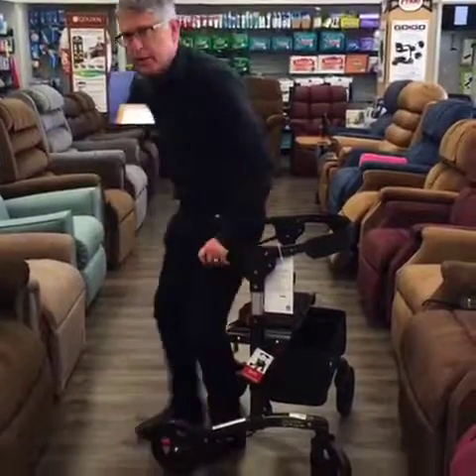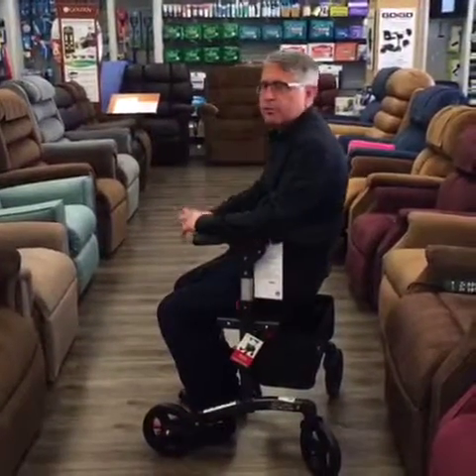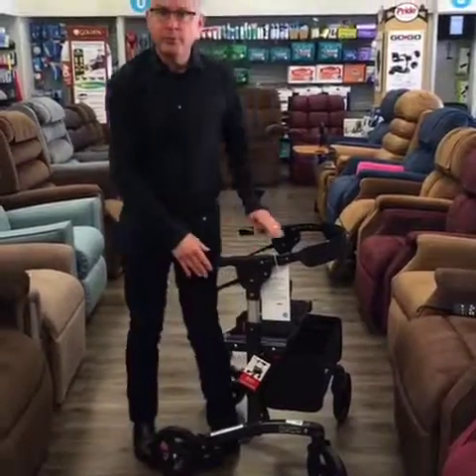Brakes lock, you can sit down. But this rollator goes further than other rollators. Let me show you how it works.